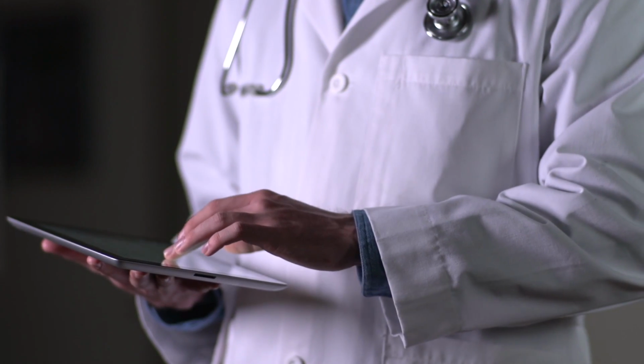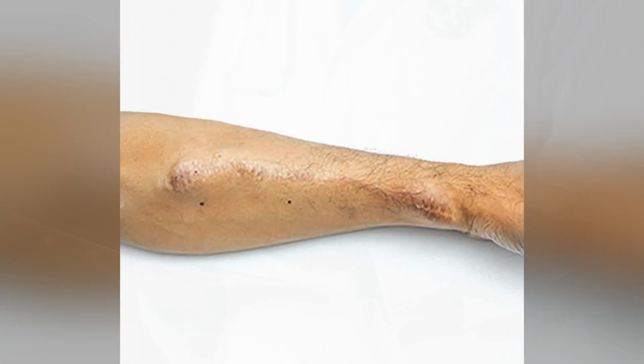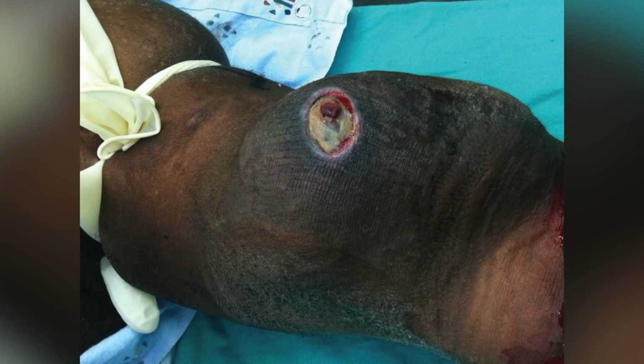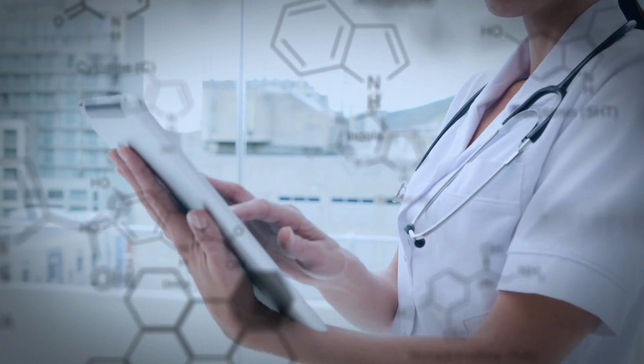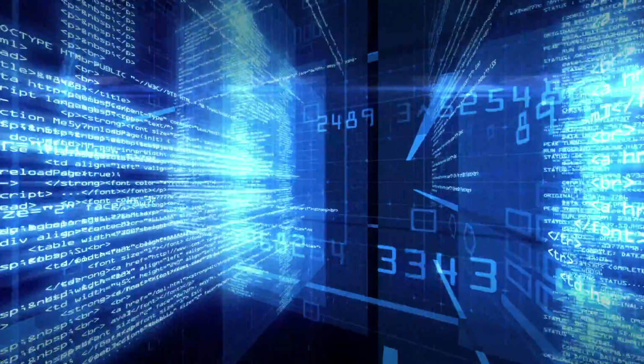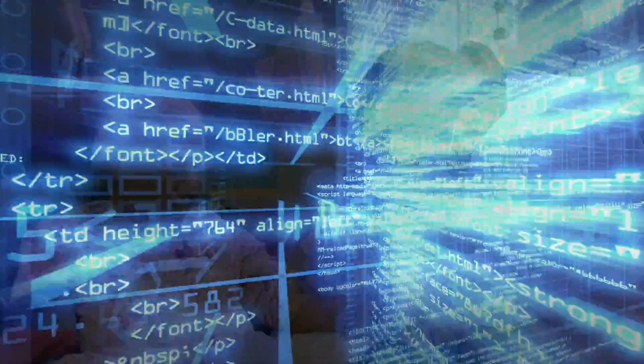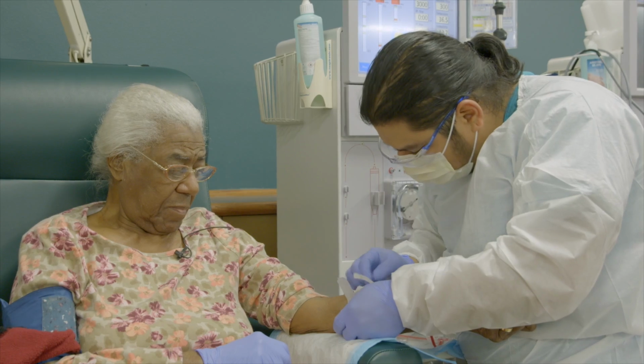Scientists at RRI have created a mobile application using vascular access images to identify and classify aneurysms that may pose a risk to patients. By quickly analyzing smartphone images taken by a caregiver, the app classifies the presence or severity of an aneurysm in the patient's vascular access. This app is an example of how artificial intelligence can help recognize patterns in data, automatically flag potential problems, and improve personalized patient care.